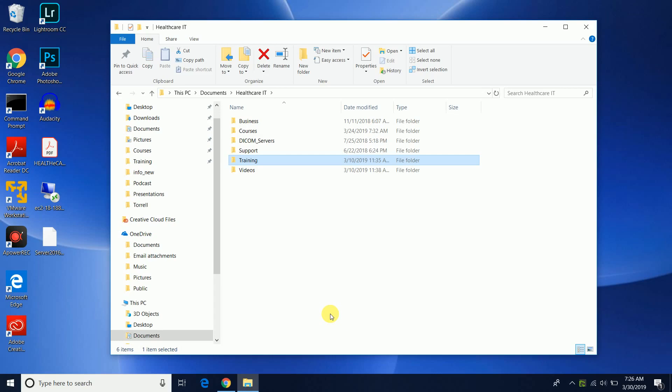Now you could actually use your Orthanc DICOM server which we've went over in previous videos. If you have it installed, it can also be used to display DICOM tags in the GUI format which is very useful. But this is for if you're not using Orthanc DICOM server, you don't have another software application or program to display DICOM tags. You can use the DICOM dump utility from the DICOM toolkit and in today's video I'm going to show you how to do it.